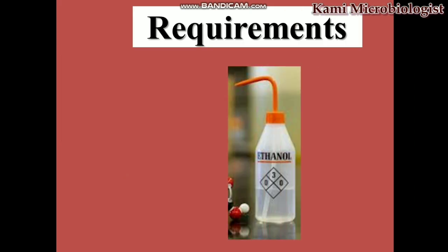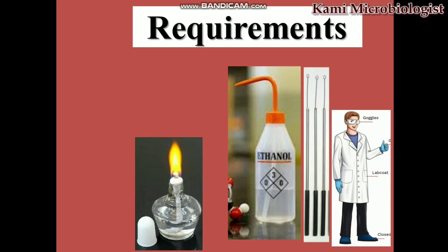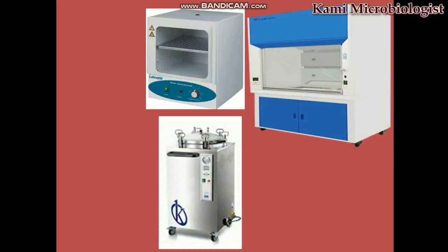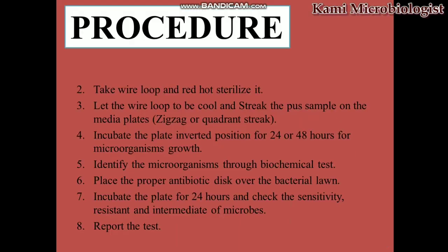Requirements: we need ethanol, wire loop, personal protective equipment. We need a burner or spirit lamp. We need culture plates. We need an incubator, LAF, autoclave, antibiotic discs, and culture swab.